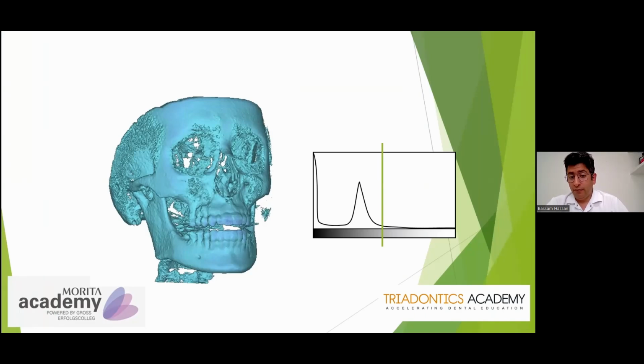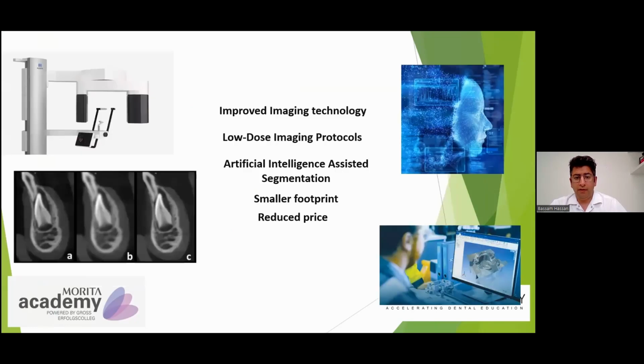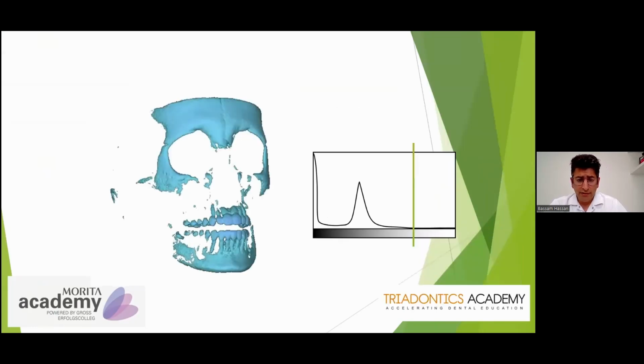Moreover, where do you put the value to segment the teeth from the bone, to do orthodontics, for instance, or to do bone level surgical guides or bone supported surgical guides? So this segmentation issue was a very, very complicated thing to deal with, and it took a lot of time for it to be solved.